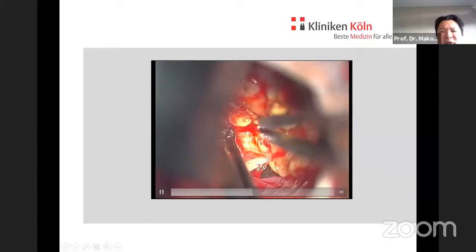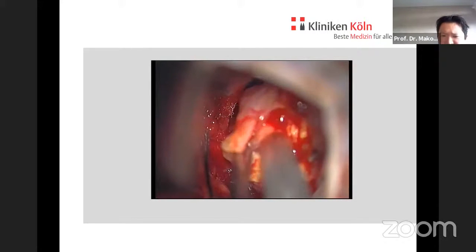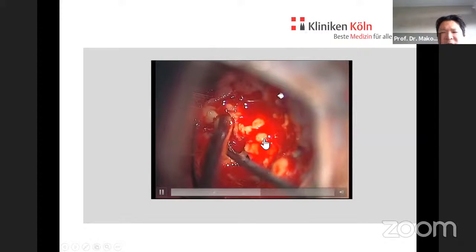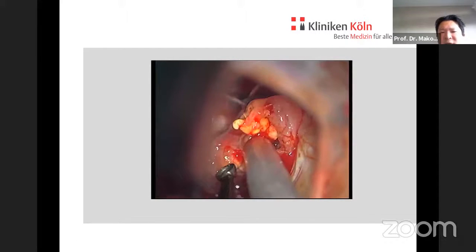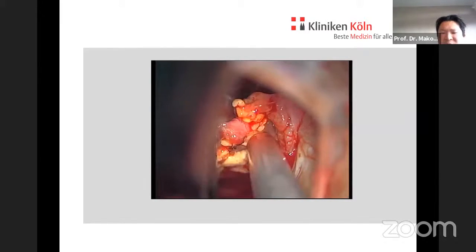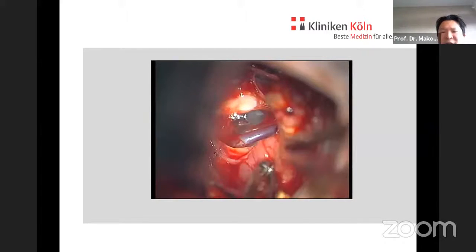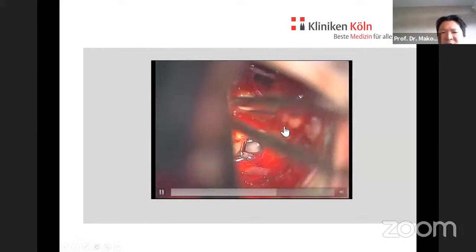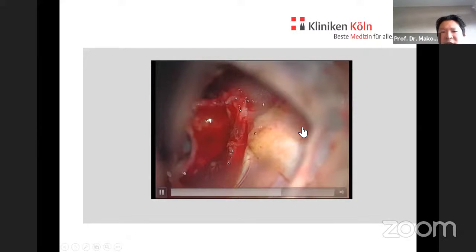So in this case, it was not the aim to preserve hearing because the patient didn't hear anymore before surgery. So the facial nerve is then followed. And the cisternal part of the tumor is then removed stepwise. Once you know where the facial nerve is, it is much easier to remove the tumor. And the advantage of the semi-sitting position is that one can do the preparation bimanually. So you can use both hands. You don't have to hold the suction in the left hand. You use both hands and do a nice preparation there.